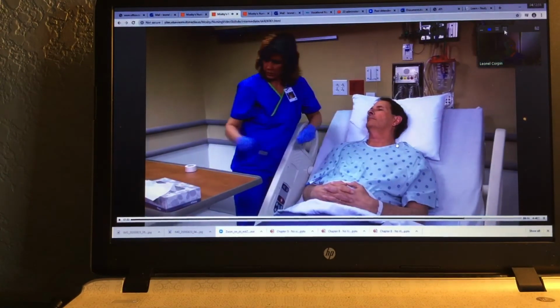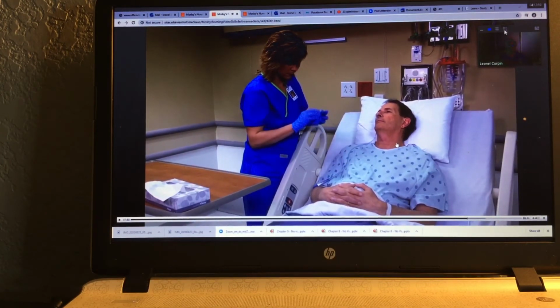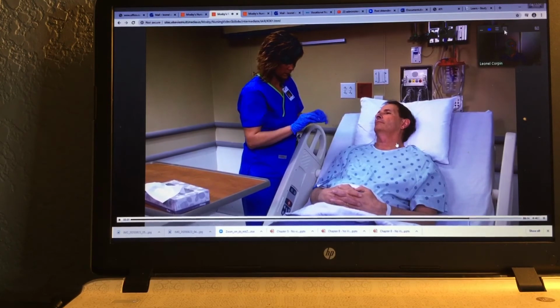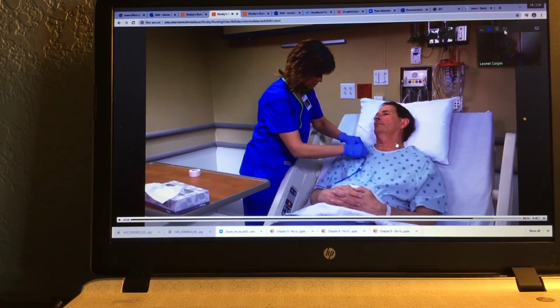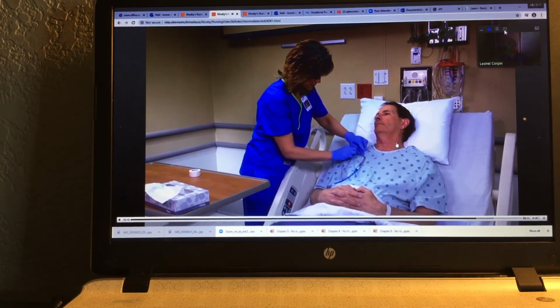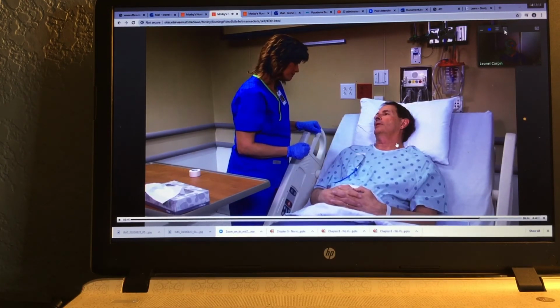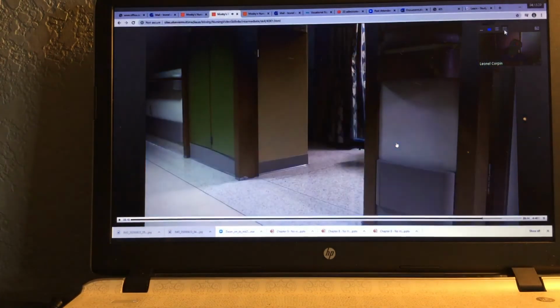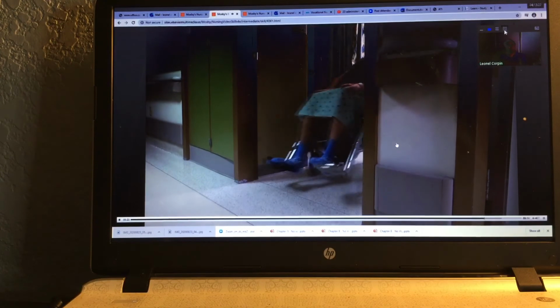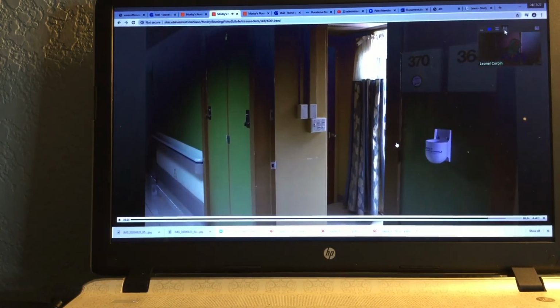All right, now I'm just going to tape it to your gown as well. Fasten the end to the patient's gown using a clip or a piece of tape. Don't pin the tube to the gown. Just like that. Can I get you more comfortable right now? Help the patient into a comfortable position. Are you okay? For definitive confirmation of correct tube placement, obtain a chest or abdominal X-ray.